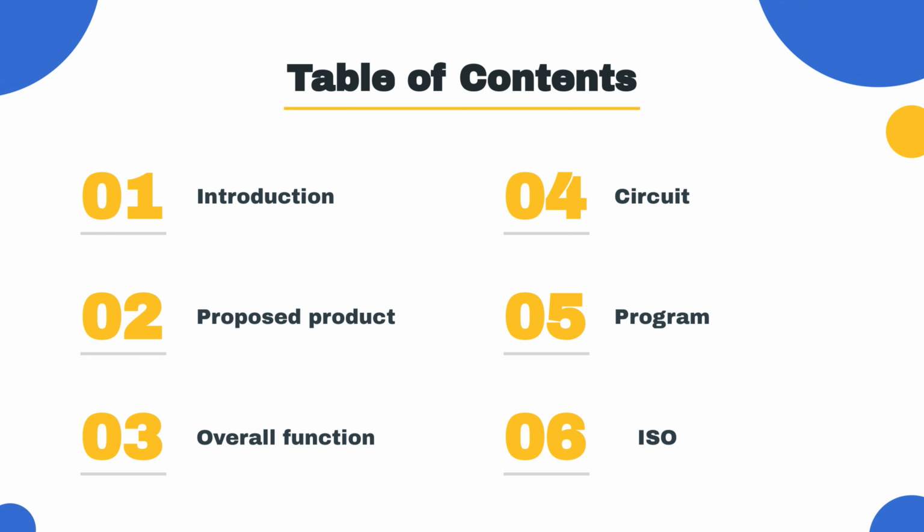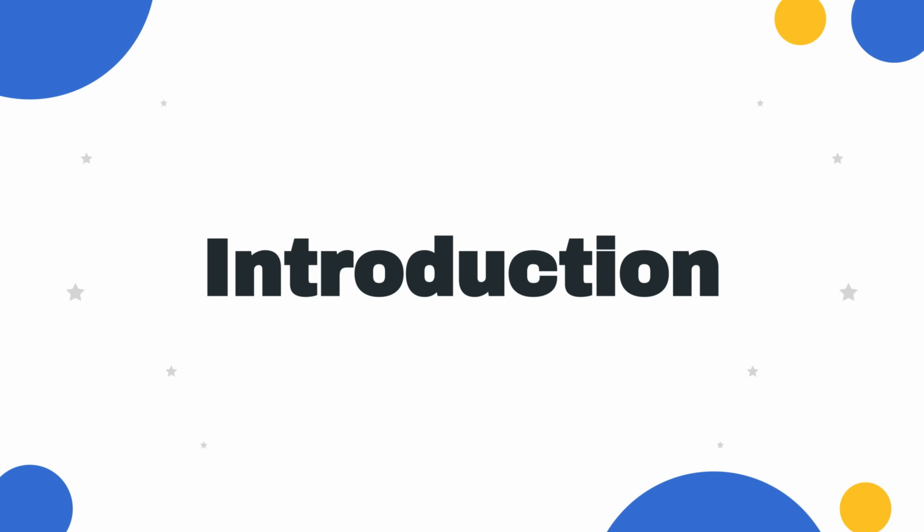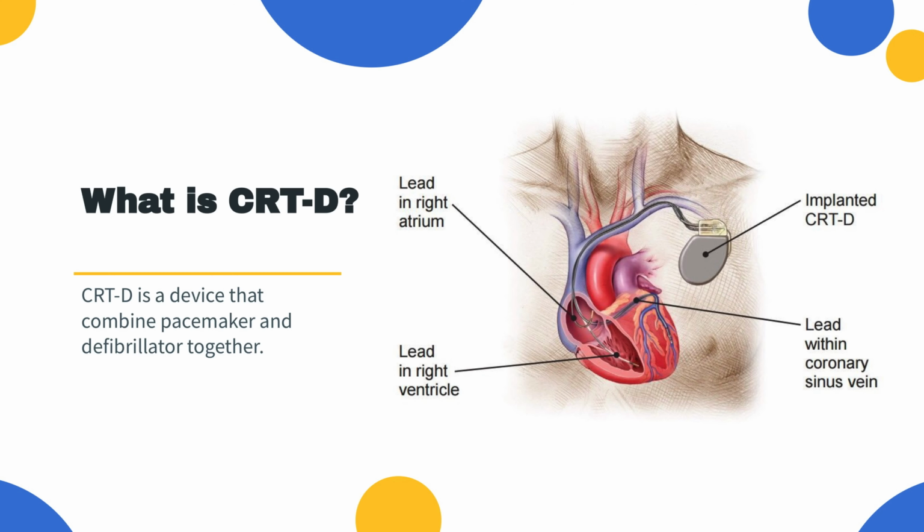This presentation covers 6 parts, including introduction, proposed product, overall function, circuit, program, and ISO. First, let's start with introduction. So, what is CRT-D? CRT-D is a device that combines pacemaker and implantable defibrillator together.